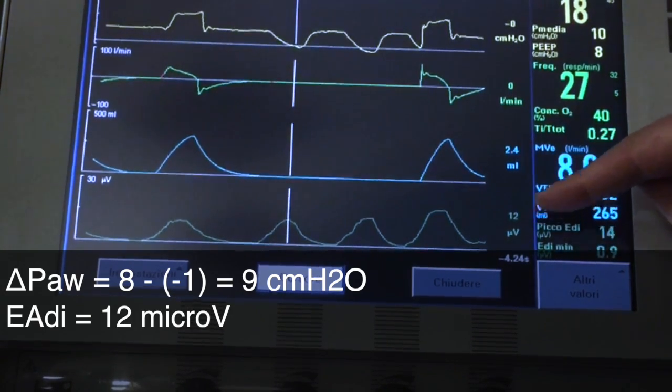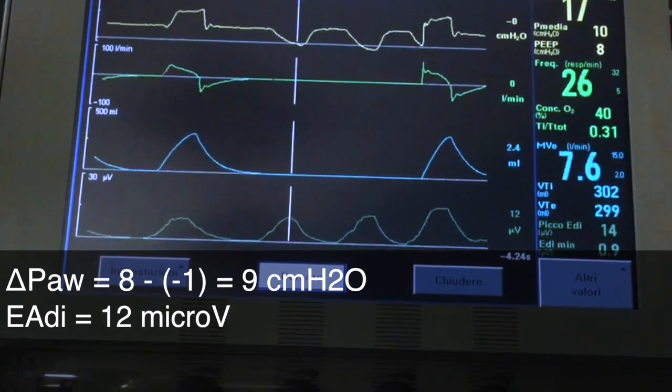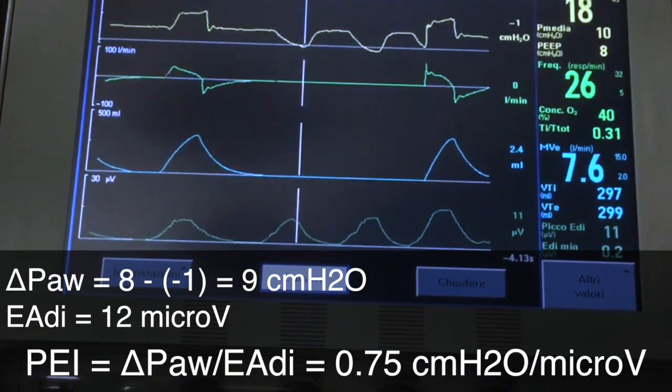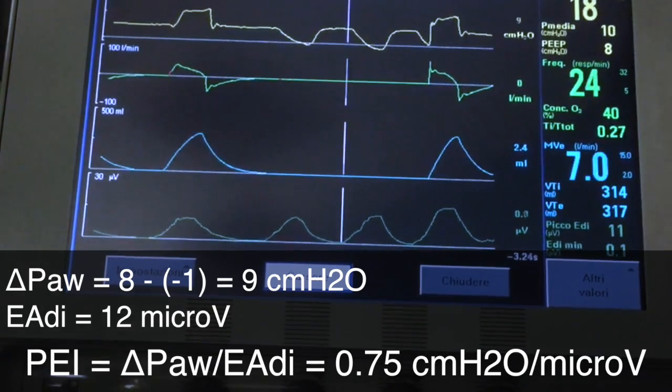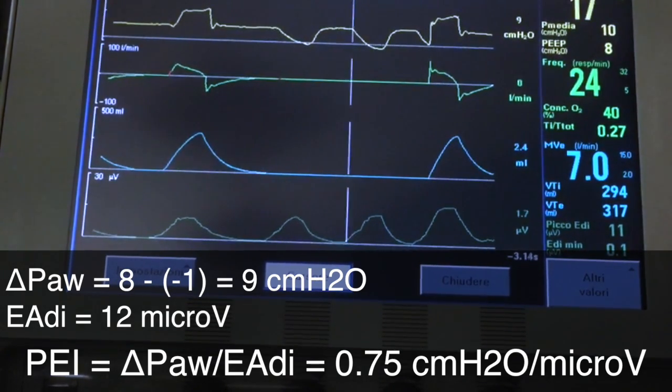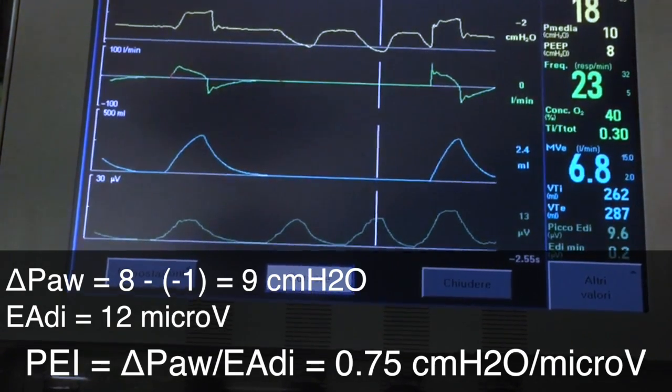PEI stands for PMUSC E-ADI index and relates the pressure generated by the respiratory muscles to the electrical activity of the diaphragm. In our case, it is 0.75 cm of water per microvolt.